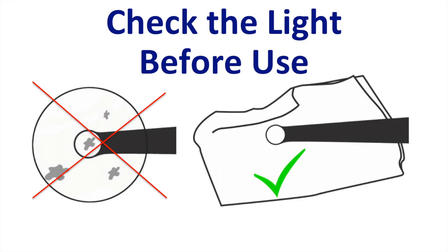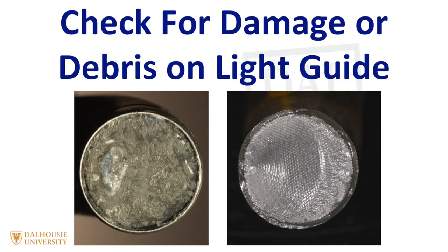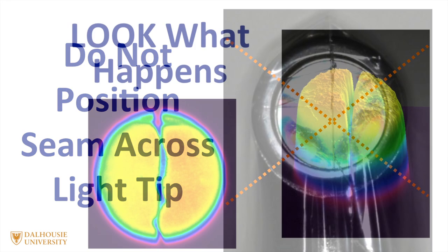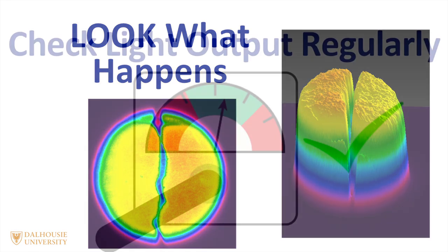Before light curing, check to see if there's any damage or debris on the end of the light guide, and if there is, remove it. I recommend the use of infection control barriers over the curing light, and these should be snugly fitting. It's important to make sure you don't position the seam of the barrier across the end of the light tip. If you do put the seam over the tip, see how this affects the light beam uniformity at the end of the light tip.